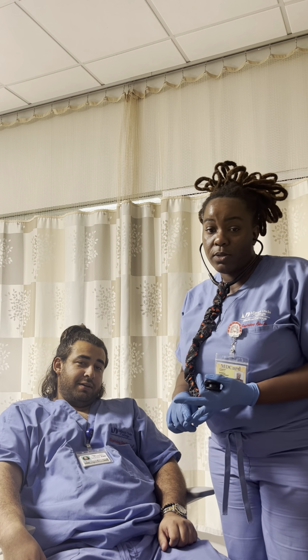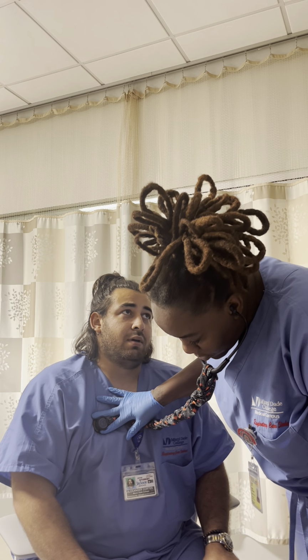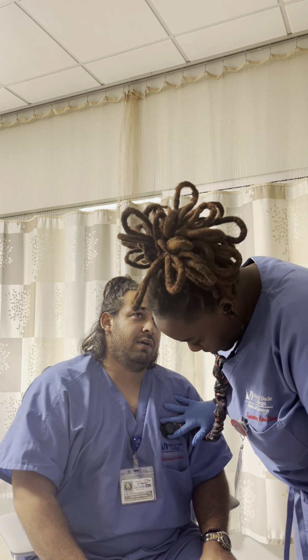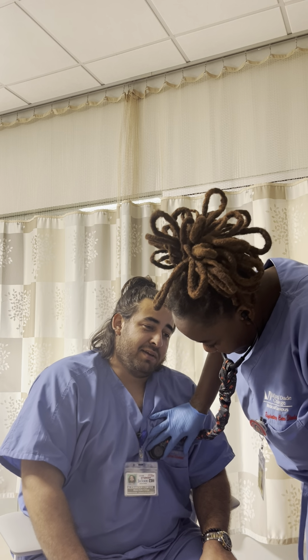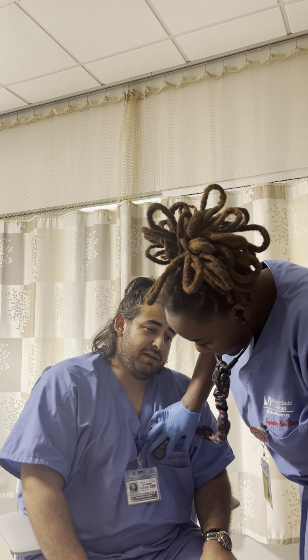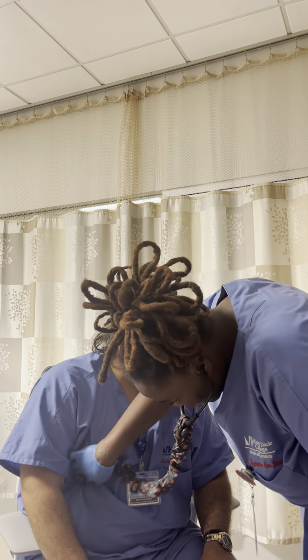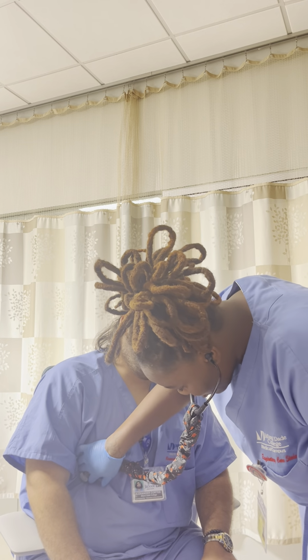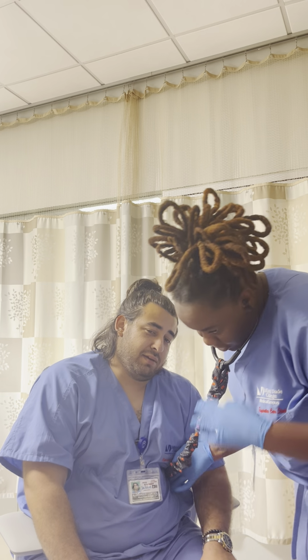Heart rate, respirations, SpO2, temp, blood pressure, breath sounds, okay? Right, magnificent.